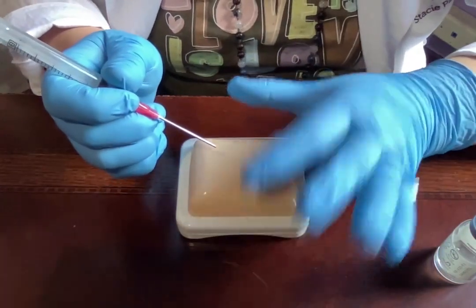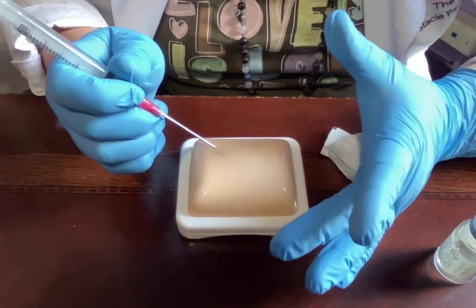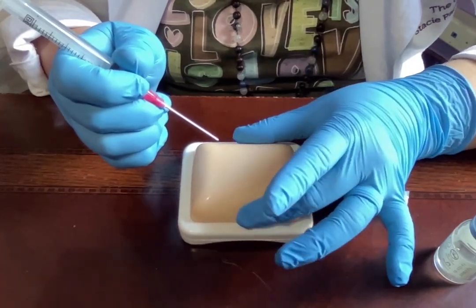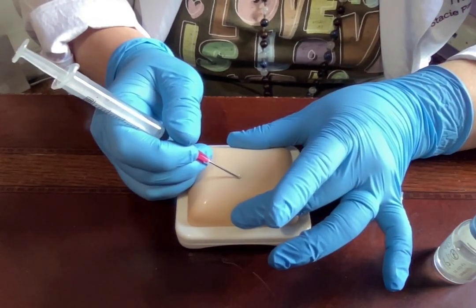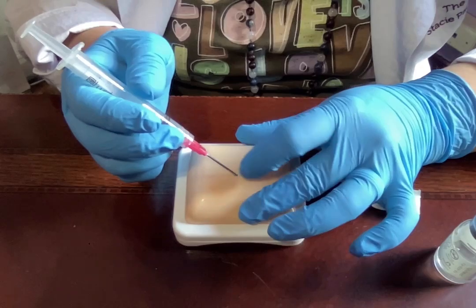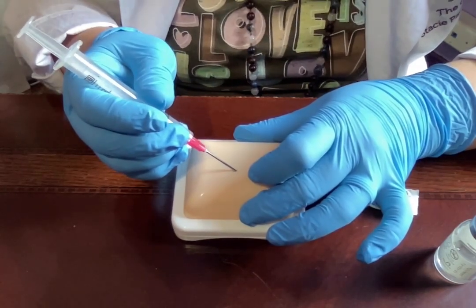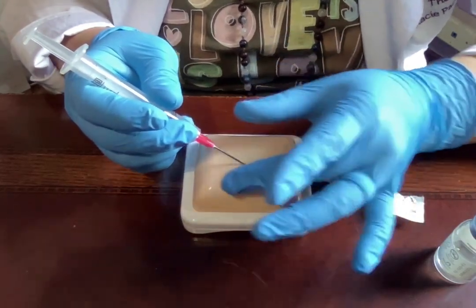It's okay if you do 30 or 50 degrees — nobody's perfect, 45 is just the average target. Take your pointer finger and thumb, or your middle finger and thumb — whichever is more comfortable. You can either pinch up the skin or rest fingers on the side for stability. I recommend pinching up because it raises the fatty tissue. Then with a dart-like motion at 45 degrees, insert the needle about half an inch — up to three-quarters of an inch is fine, but no deeper than that.